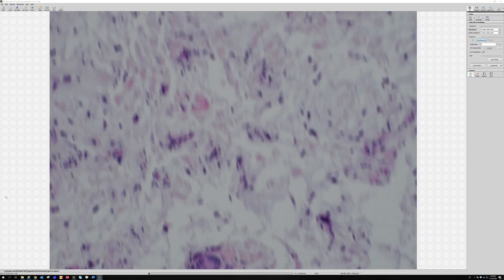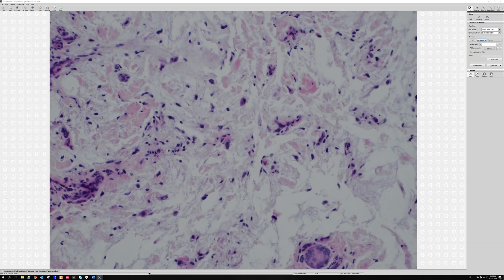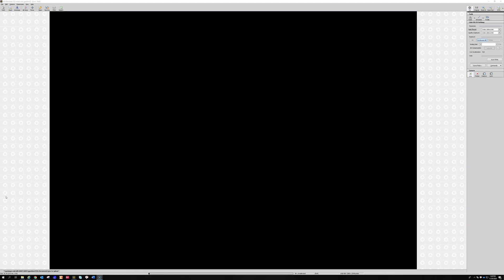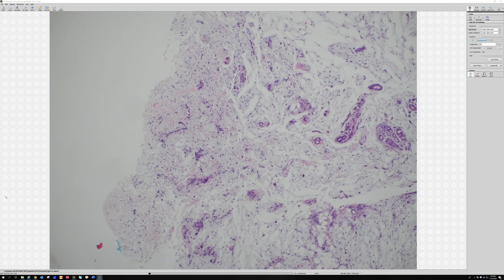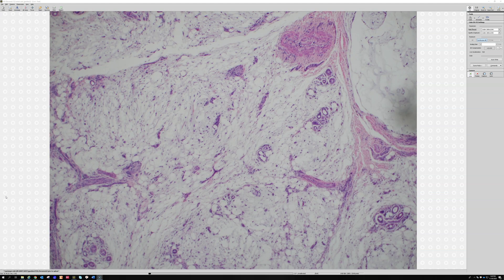Pseudolipoblasts are a common finding in myxofibrosarcoma — an important sarcoma to be aware of. Unfortunately, there is no specific immunostain pattern; it's pretty much based on appearance and clinical situation. Some other tumors can mimic this — for example, pleomorphic liposarcoma can have myxoid areas that look very similar, and dedifferentiated liposarcoma can do the same thing.